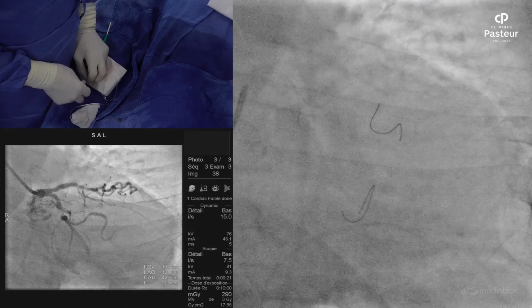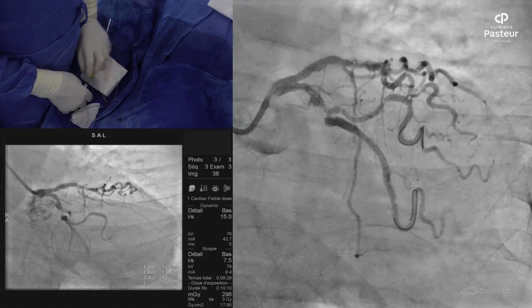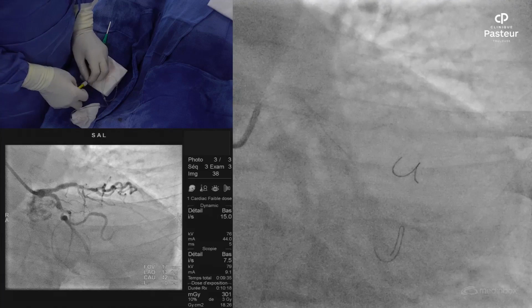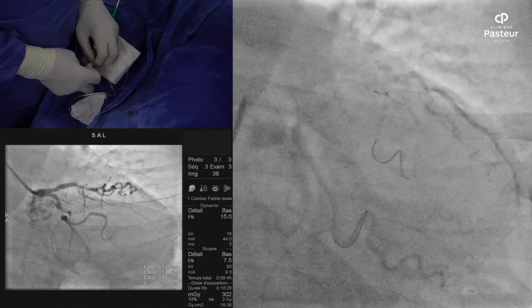And if we have any doubt about stenting the second marginal first, we would have all the difficulty to recross. It's not too bad, but you see now we have to advance a little bit more the distality of the wire. Difficult. So I'm turning slowly, you see the torquer, clockwise, counterclockwise, and try to negotiate this curve slowly. Never push. Never push, and we have to be patient.